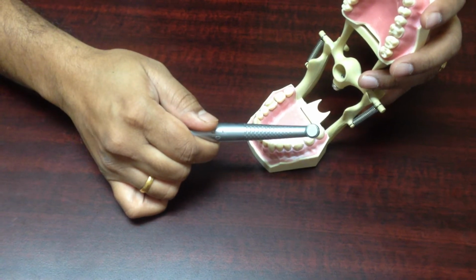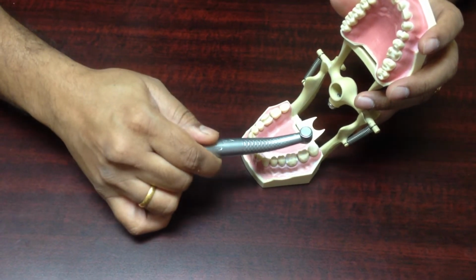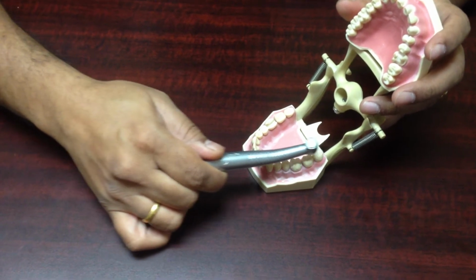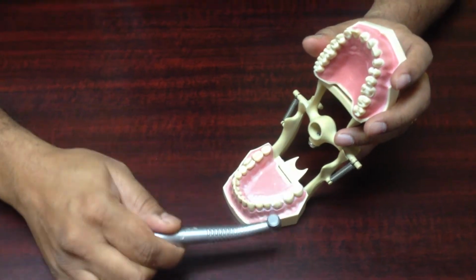Then the CAD cam machine, we plan how we want to have it cut in the machine, and then we just let it sit here, and the drill does the cutting for us. And because it's already mounted on this little rail system, it's fixed in place. So when it scans and when it cuts, it's the exact same planes.